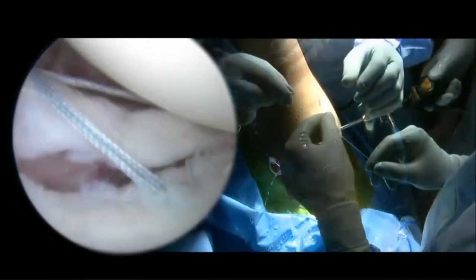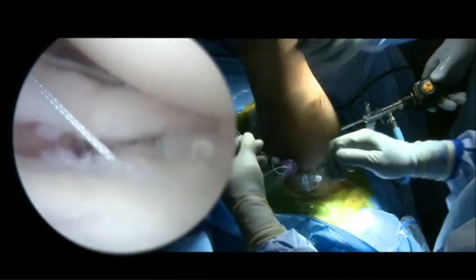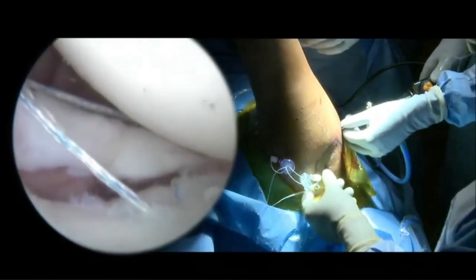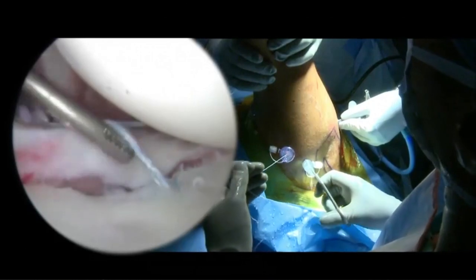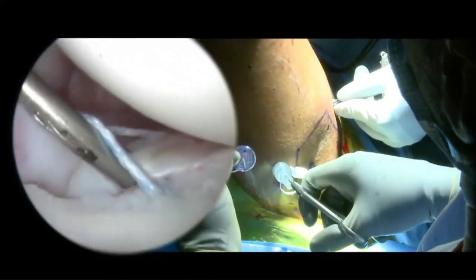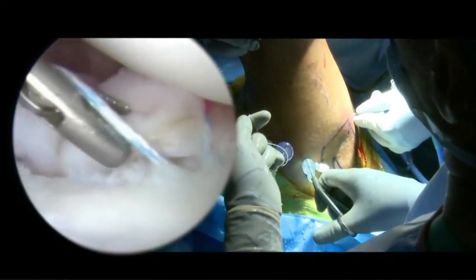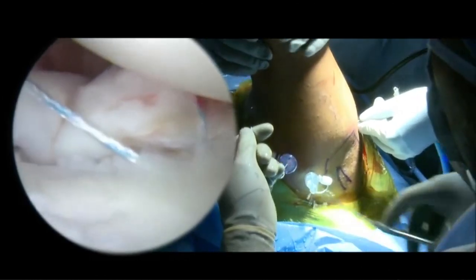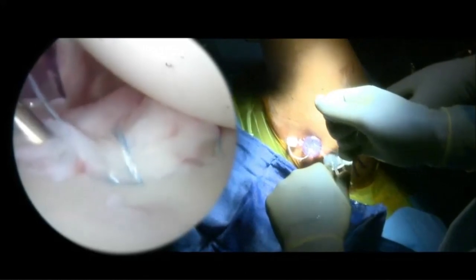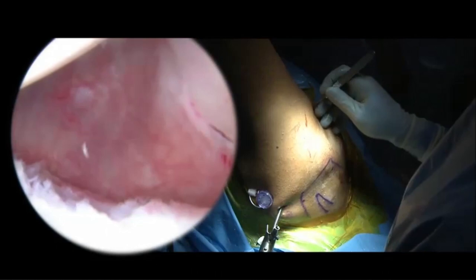We grab the capsule and the labrum to shift the capsule from inferior to superior and from lateral to medial. We pass the simple suture through the loop of the knotless suture tack and retrieve it through the eyelet mechanism so that it locks on itself. We then tension the soft tissues prior to securing the knotless suture tack. A little grasper pulls the labrum and capsule superiorly as we tension the final construct to achieve excellent tension in the inferior glenohumeral ligament complex.